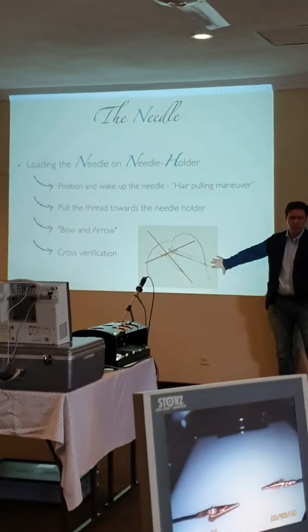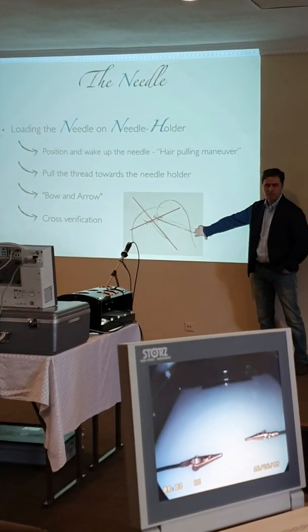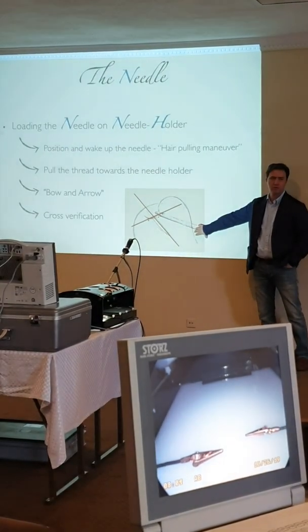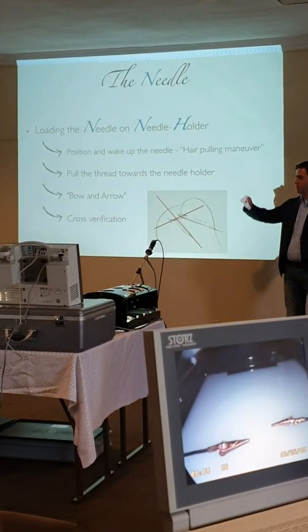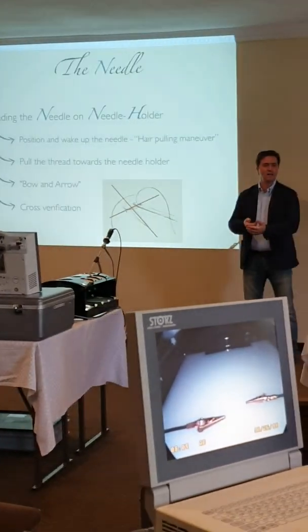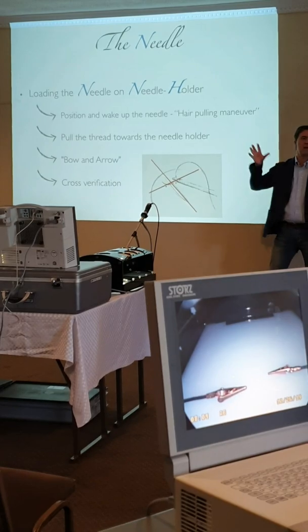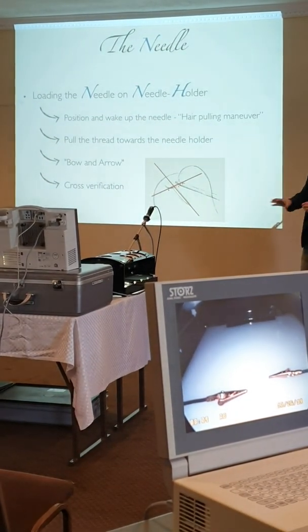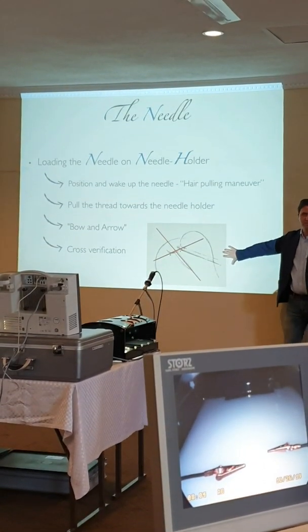This picture is really important to know where the needle comes in and where the needle comes out, because I'm sure everybody has had this problem. You pass the needle and try to find where it's coming out. So if you did this before, it's like magic. You will find it easily. Okay? So don't forget this figure.